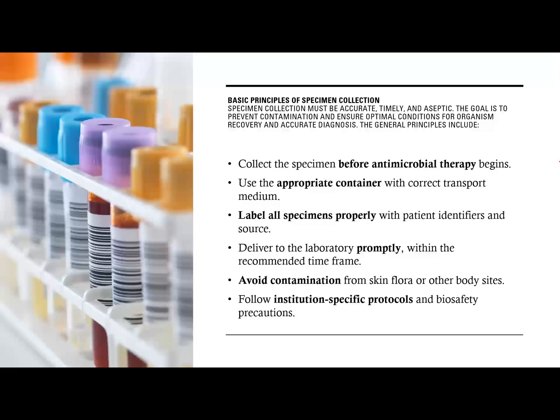Now, those are the basic principles of specimen collection. It's very important, class, that you are able to accurately, timely, and aseptically collect samples. So it has to be accurate, it has to be on time, and it has to be free from contamination, or it should be clean. The goal is to prevent any contamination and ensure optimal condition for organism recovery and accurate diagnosis.